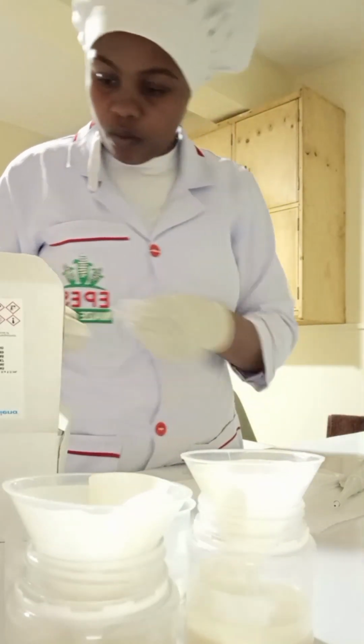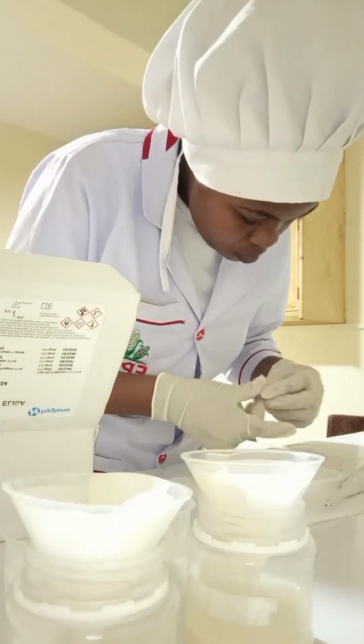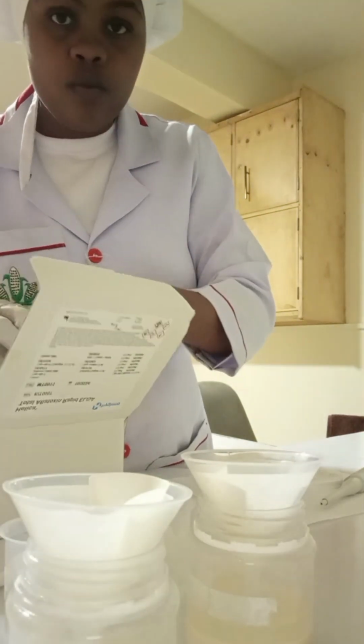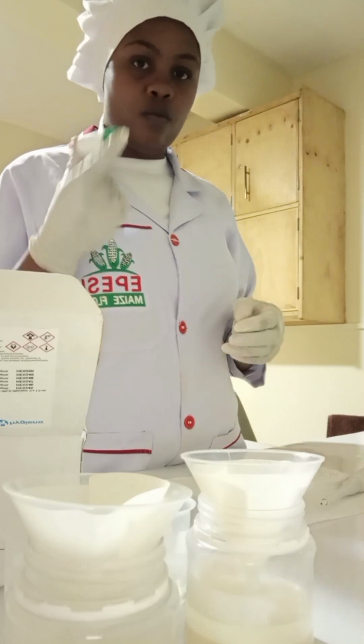Those are the green ones. Those are the wells, the mixing wells. Hapo ndo mixing inaweza fanyika. You take the wells. You see, I had to sample, so nimechukua mbili.